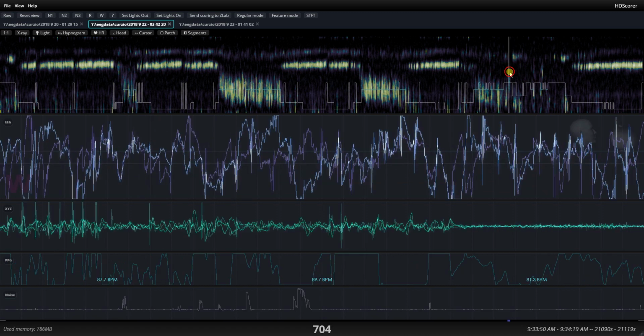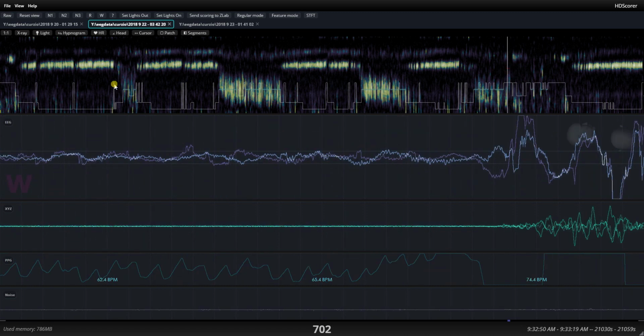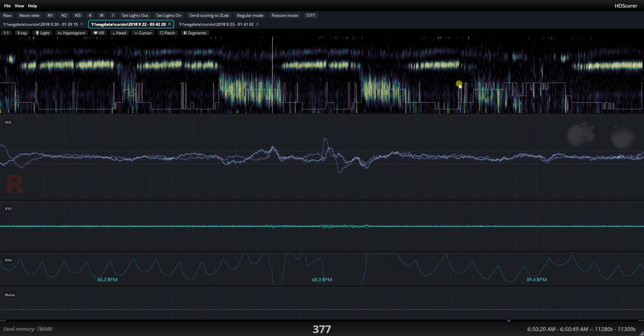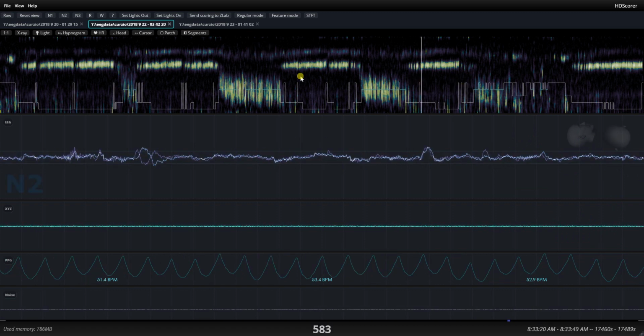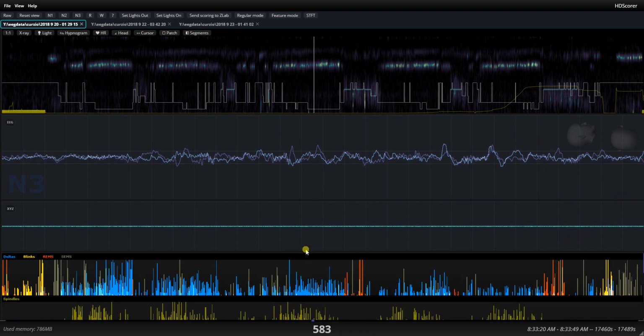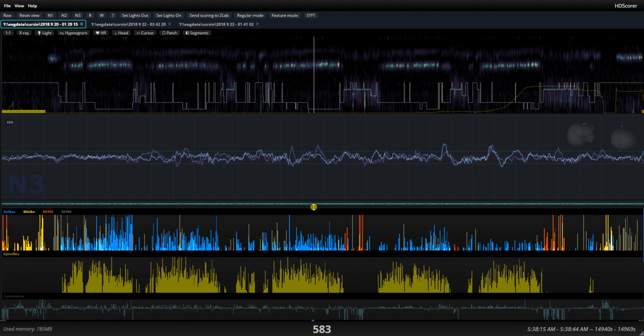Is there anything else that's substantial here? I don't think so. Well, this is a first preview of the auto scoring function in Zmax, which, as you have seen, doesn't just yield a hypnogram, but it yields a bunch of information, including all the features. And if you're a sleep researcher and you're trying to do more precise quantitative analysis, you might not want to focus on the hypnogram itself. You might want to focus, for example, on the amount of slow eye movements, which you could get from this wave right here in beige.